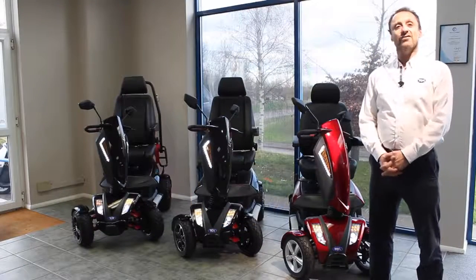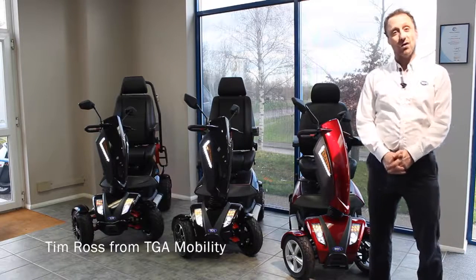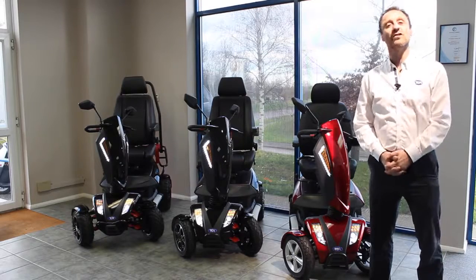Hi, I'm Tim from TGA and today I wanted to run you through some of the Vita range of mobility scooters and just talk about some of the features and the benefits that you as a user can have.